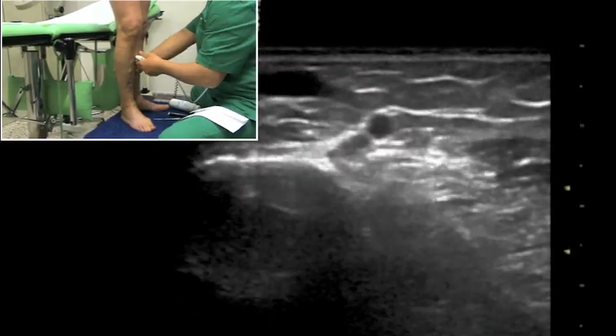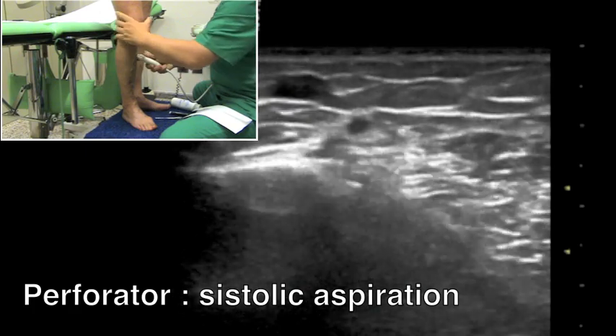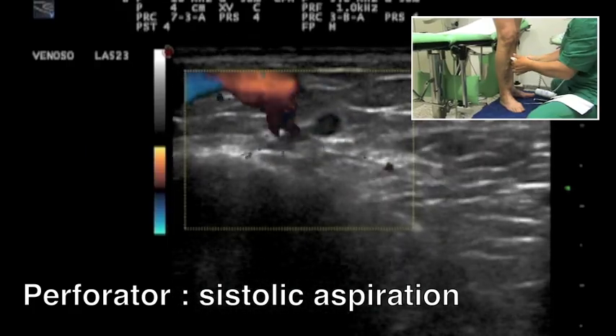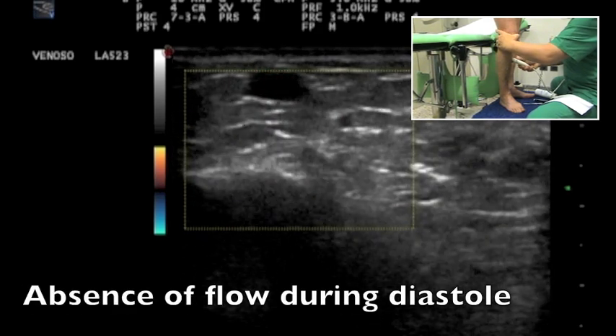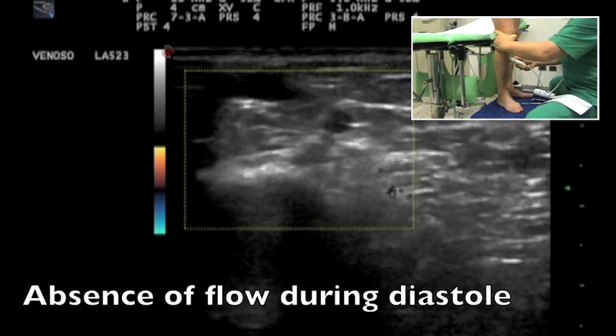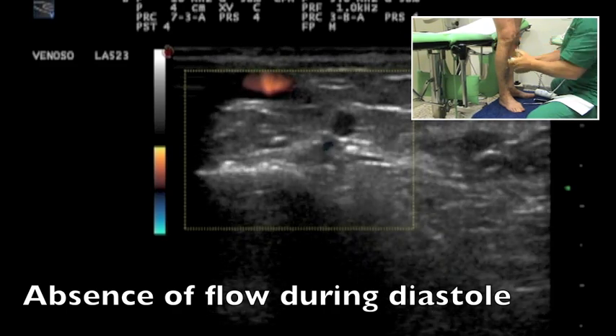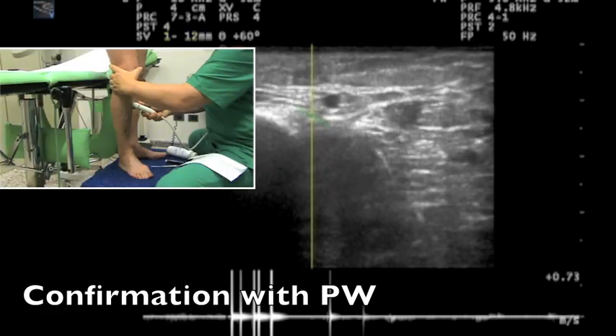A dynamic muscular pump maneuver elicits a systolic flow, whilst no flow is seen during the diastole. The absence of diastolic flow is confirmed by the pulsed Doppler check.